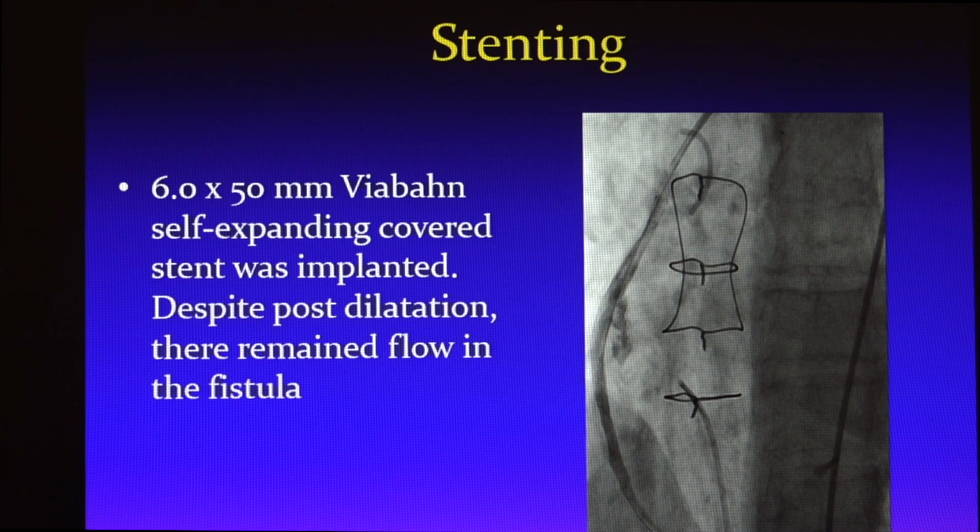We deployed actually the first covered stent. However, unfortunately, we still had some flow. We dilated this very aggressively. We still had some flow. So we ended up doing another stent, putting another stent inside the first stent, and dilating both. And we got actually great results.